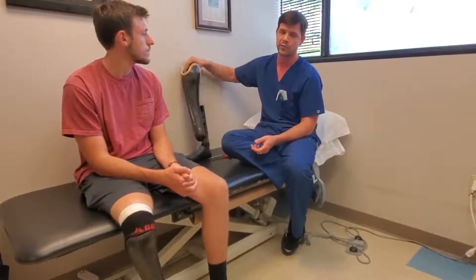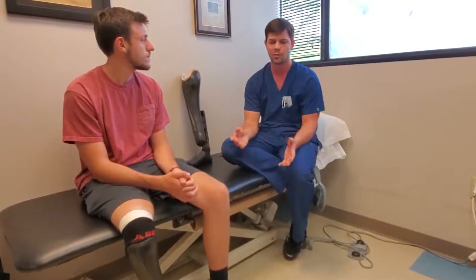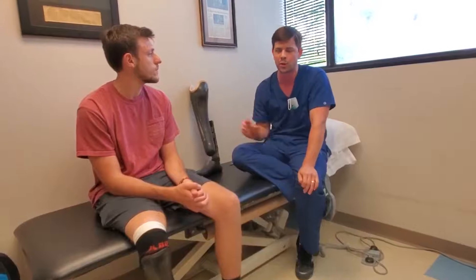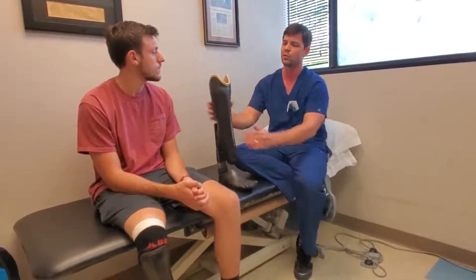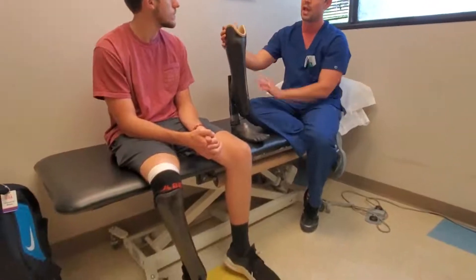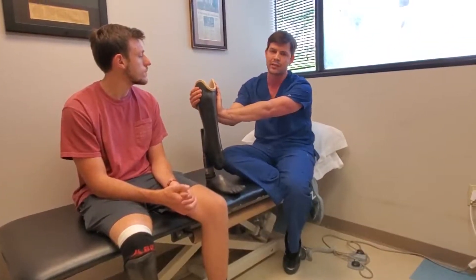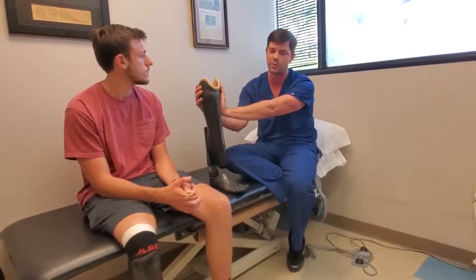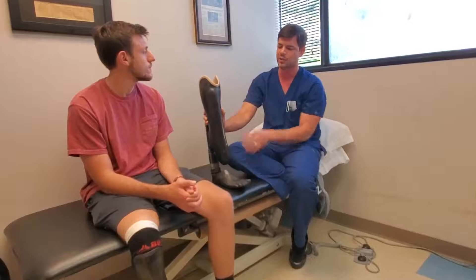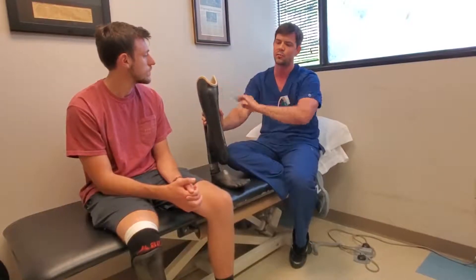Because of his previous high activity level, he's in college now. He still runs and enjoys being active, but he's not sprinting at the competitive level he once was. He's been used to having trim lines around his knee that encompass his medial and lateral condyles. Trim lines like this are great for support during high activity to prevent strain on the knee. What we've transitioned to now is basically the same setup with a stove pipe P-light, but we've lowered his trim lines.